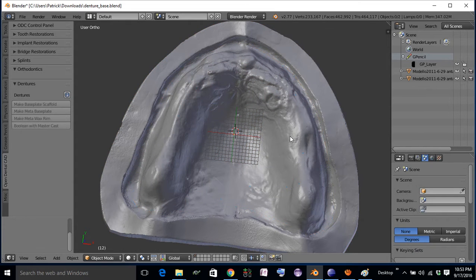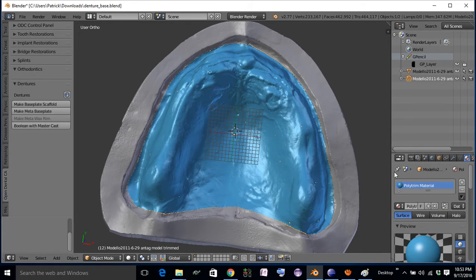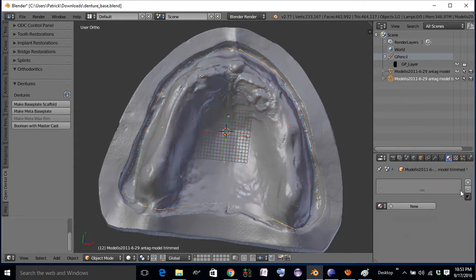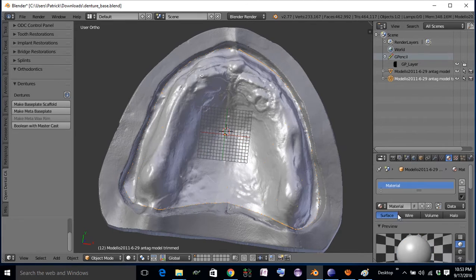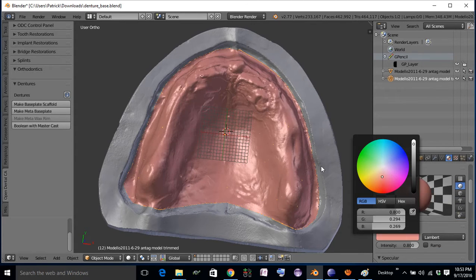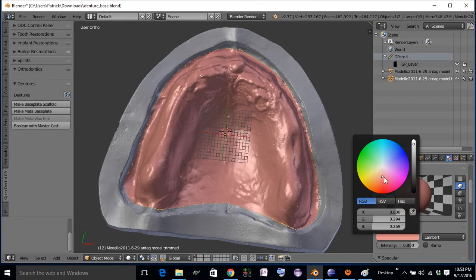I'm going to take this material away and add a material that looks a little more like gingiva, since this will become our gingival base plate.